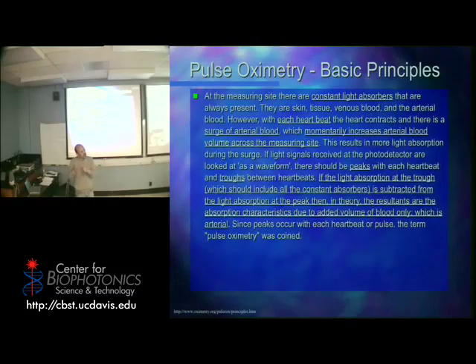So as they started messing around more and more with the light and having these lights that were controllable. Because remember, before, what did they have to do? If you wanted to get a specific range of wavelengths of light, you had to have a really, really bright light to begin with, and then you had to have a filter that blocked as much as possible of the light that you didn't want, to let the light that you wanted go through. So you usually had to start with a very, very warm light source, hot, okay, that you had to be constantly cooling to draw just a little bit of that energy of those photons to come through. So that made a lot of that experimentation tough.